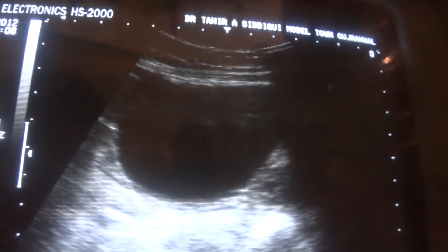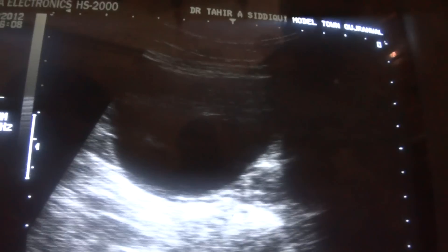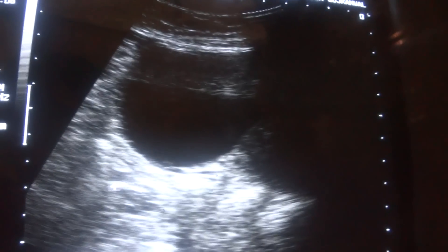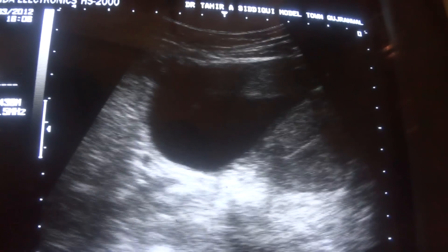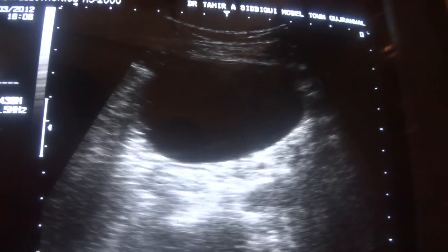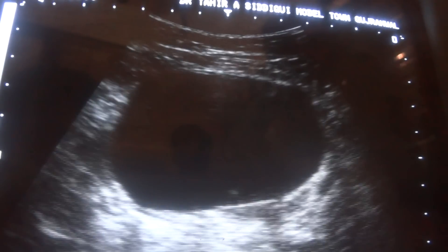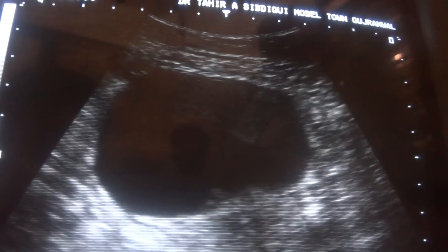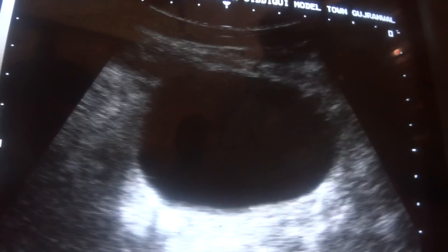Moreover, the second criterion: do we see posterior acoustic enhancement from the cystic area? Yes, here — this is the posterior acoustic enhancement and this is the strong back wall. So this is a right ovarian cyst. It is simple in the sense that there is no debris, no septation, no calcification seen in the cyst — neither marginal nor internal.